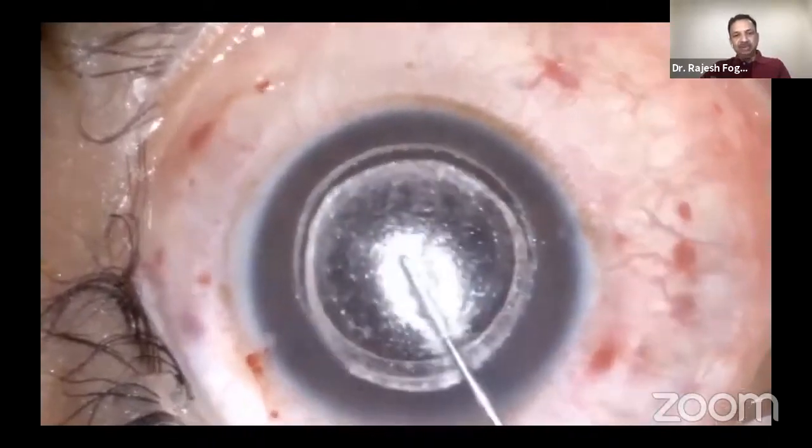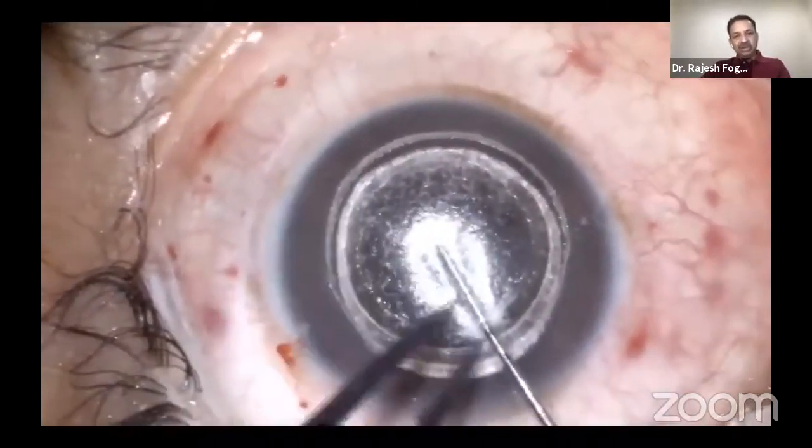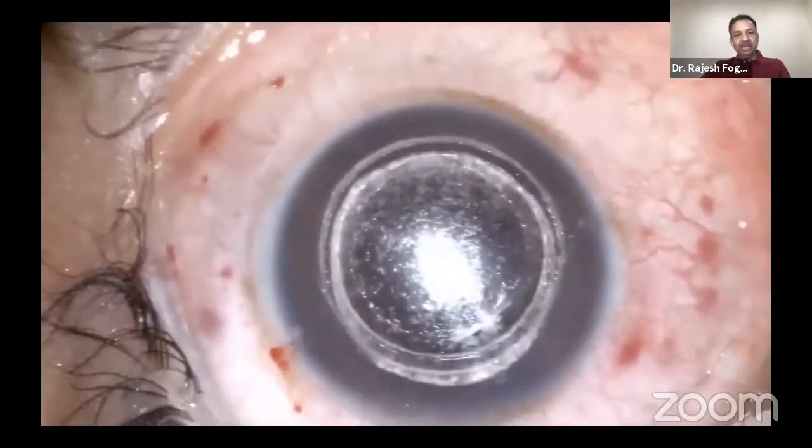At this point of time, if you again feel the pressure, you can use a Sinskey hook and release some more aqueous from the side port, and then come back and inject your air.